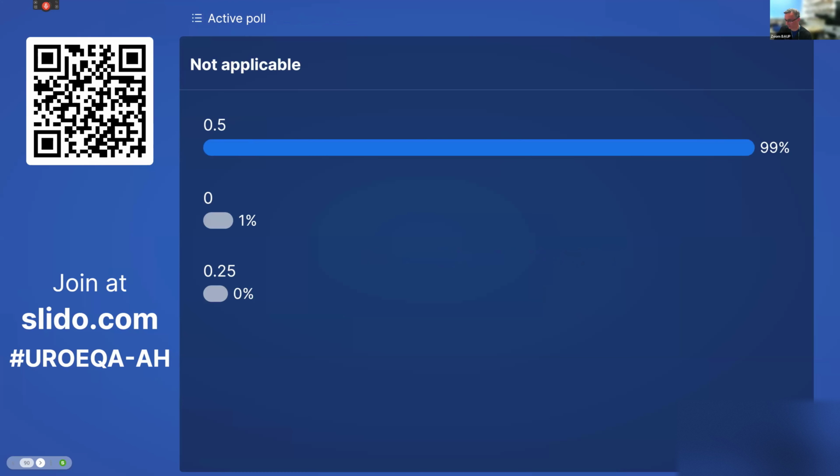So not applicable by far and away the commonest one. So 0.5. Grade 1, 0. Grade 2, 0. And grade 3, again, 0.